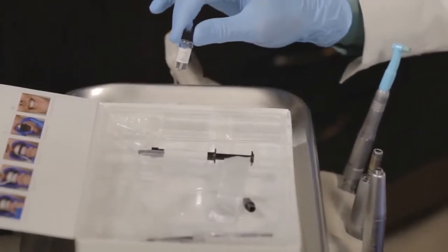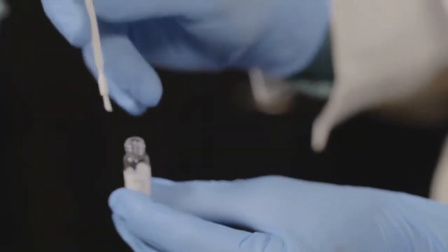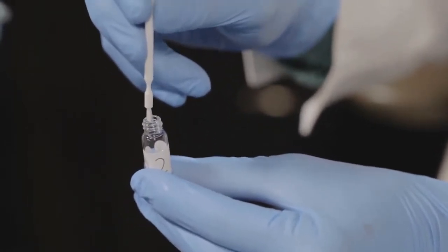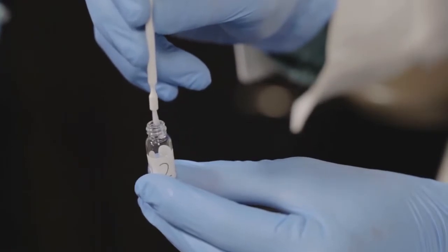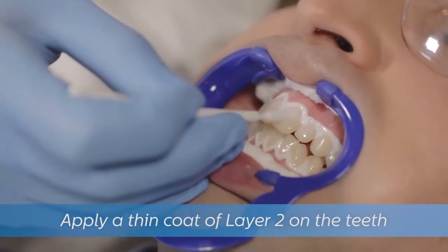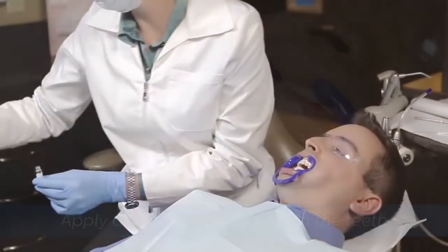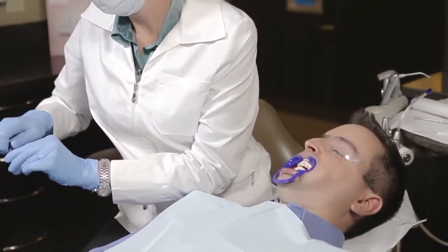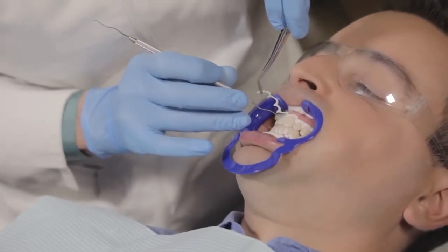Next, it's time to apply the sealant layer. This technology seals the hydrogen peroxide so you can send the patient on their way immediately after application. Open the glass vial of the innovative sealant labeled 2. Using the second of the two provided application brushes, apply using the same technique as the first layer, once again avoiding the soft tissue. Let the teeth air dry for 30 seconds. When the teeth are dry to the touch, carefully remove the Liquidam barrier.